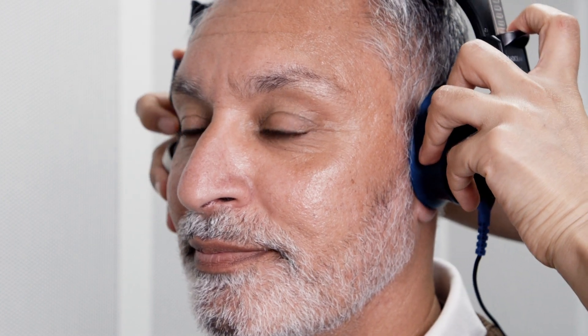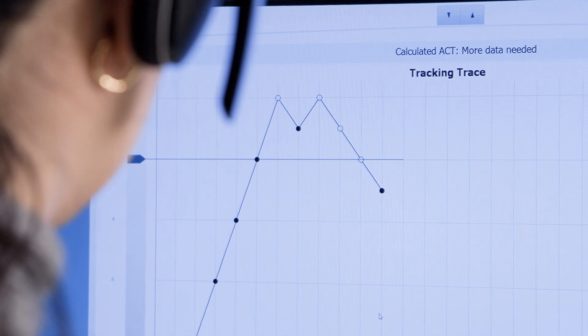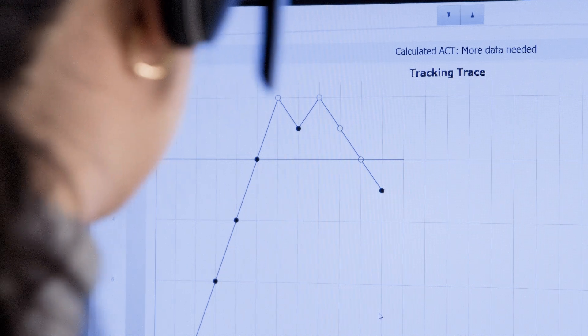The Audible Contrast Threshold Test, also known as ACT, allows you to assess how well someone can hear in background noise. It does this by using a special signal that is non-language specific.